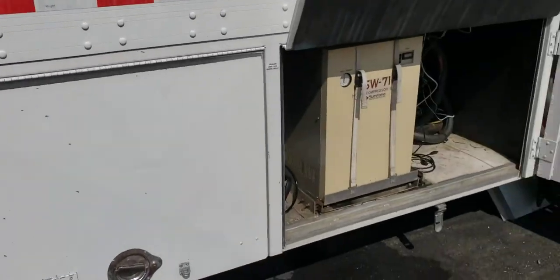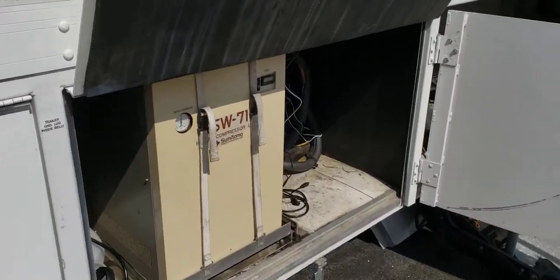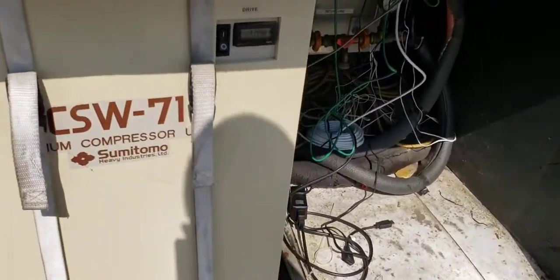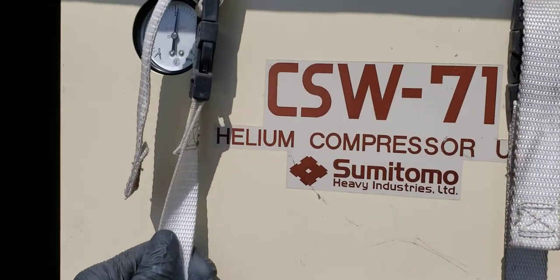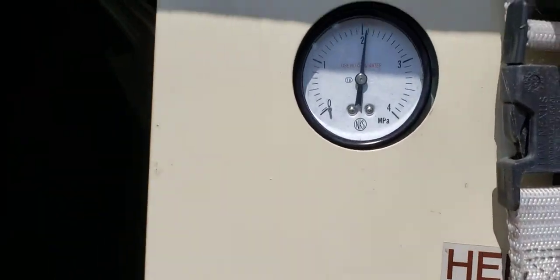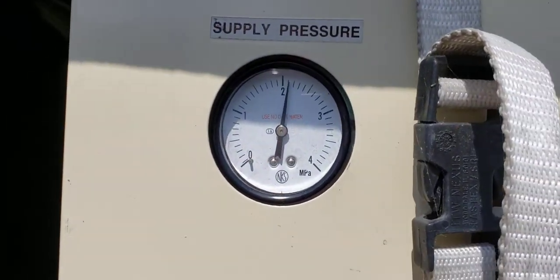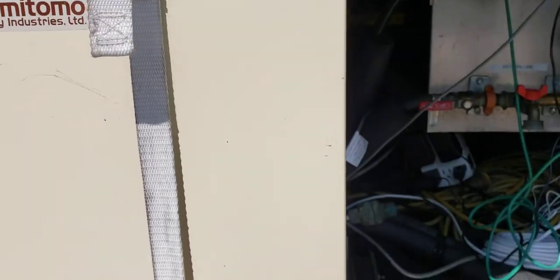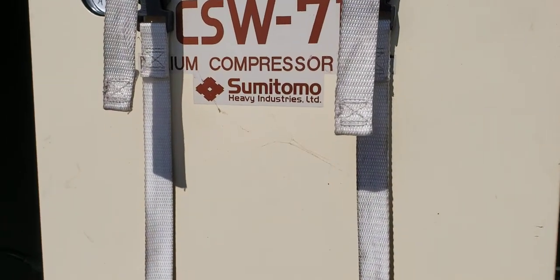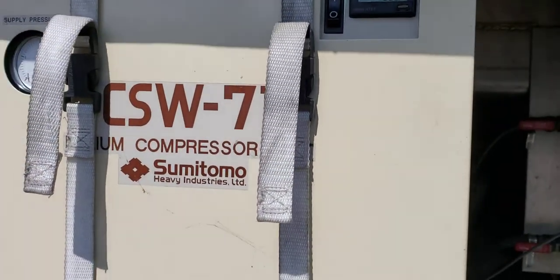This is a CT scan unit for pet imaging. Here we have the helium refrigeration unit - it says helium compressor and it is chirping away. I don't know much about this particular unit, but it is a refrigeration unit where the refrigerant is helium.